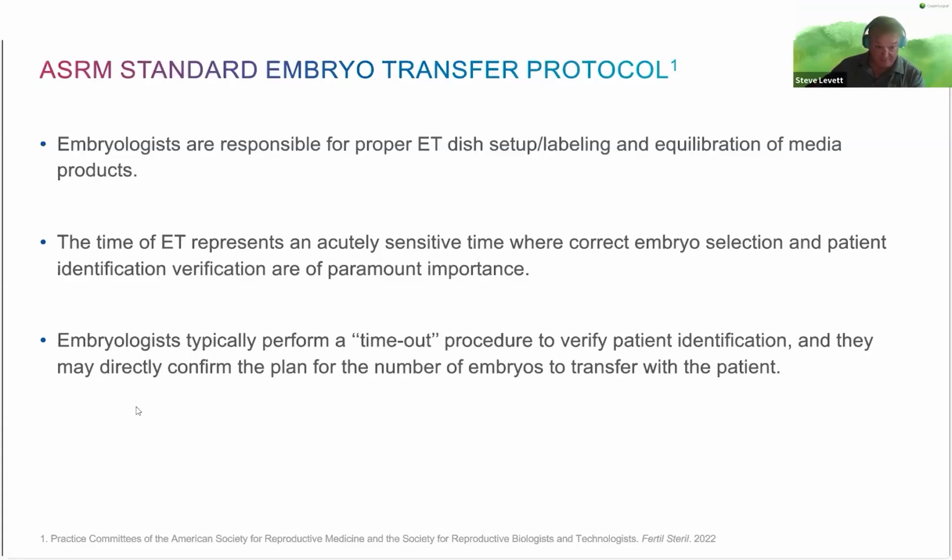And to that extent, the last point here, embryologists would typically perform a timeout procedure, so we can verify that all of the information that we have is correct. So we've got the right patient, we've got the right embryo at the right time, and everybody's ready to go. So again, they're not helpful in teaching us exactly how to do the transfer, but they're setting the scene so that we have everything in place to make the transfer as successful as possible with the right embryo at the right time for the right patient.